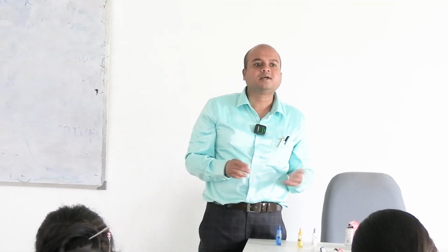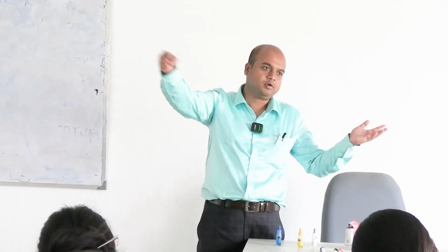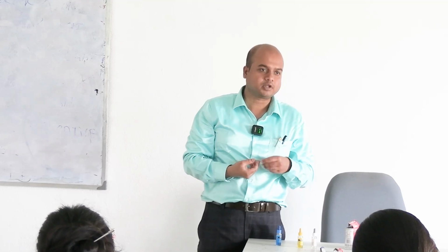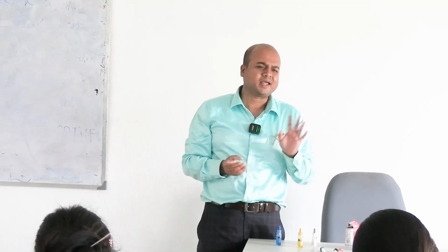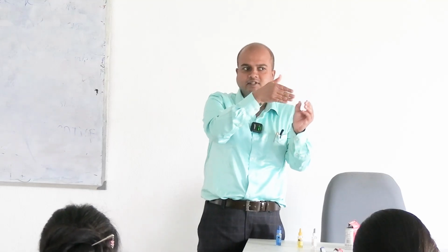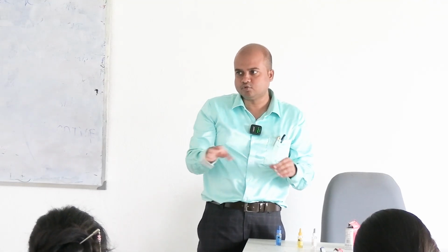As beginners, sometimes we take 3 or 4 different slides, at least 3, for A, B and D, but actually it is not required. If we do it carefully, we can do it in 3 sections of the same slide, just taking care that these do not get mixed.